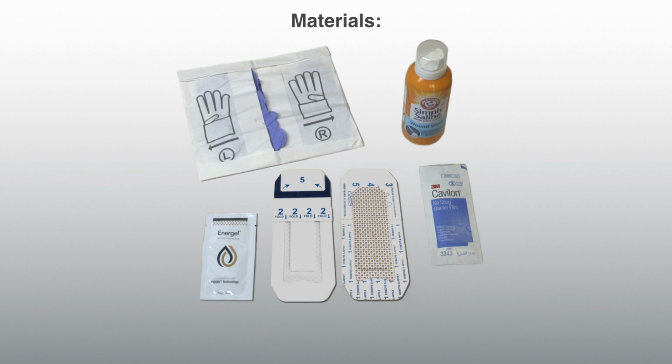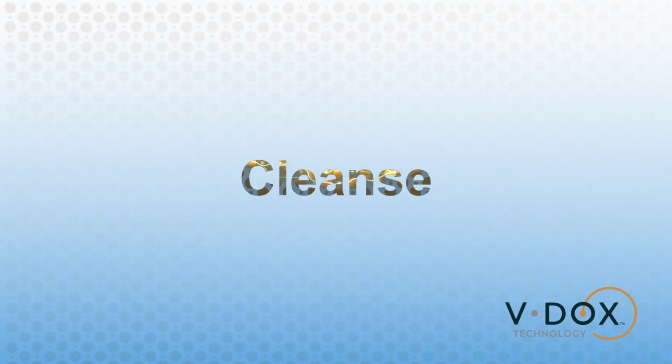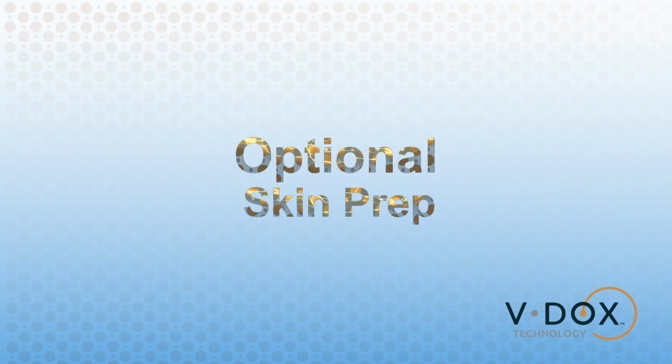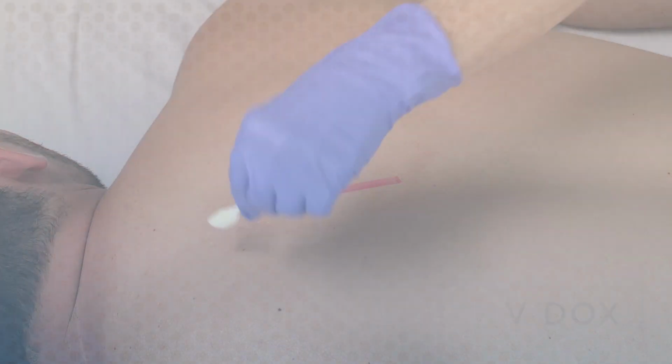To apply, you will need the following sterile materials: 1 or more Procellera FlexEFit antibacterial wound dressings, Energel wound hydrogel, sterile saline or water, gloves, wound cleanser, skin prep. Cleanse the wound area with an appropriate wound cleanser. If desired, apply skin prep to the area surrounding the wound.